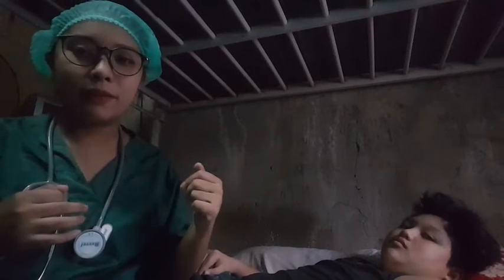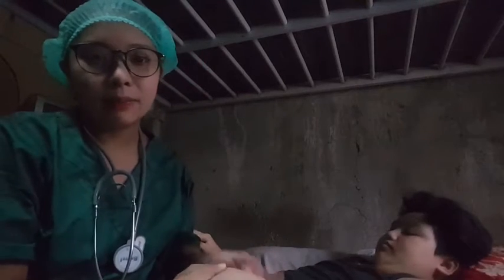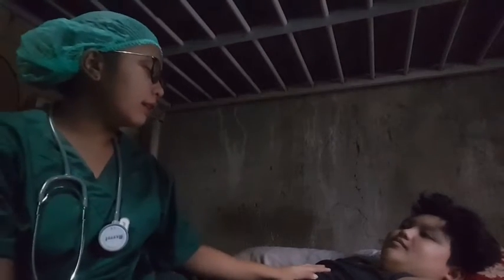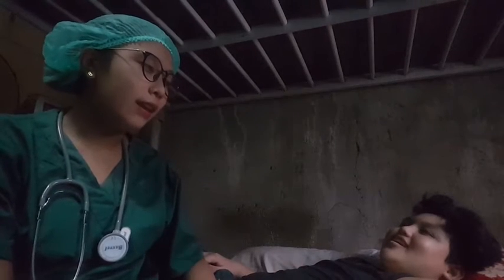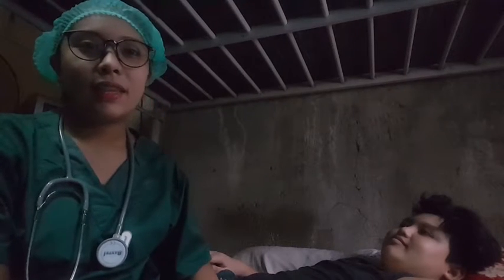First is to identify the patient with at least two identifiers. In the hospital, we use name tags, but we also use double identifiers such as name and birthday. So I have here my patient. State your name, please. Daniel Garcia Alfonso. And birthday. February 23, 2010. Okay. Now is to gather all the needed equipment.